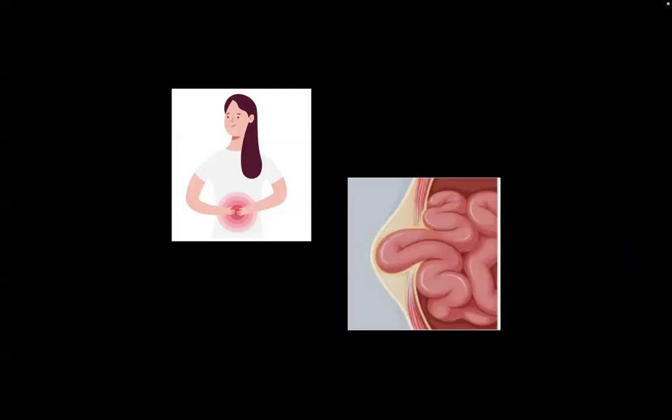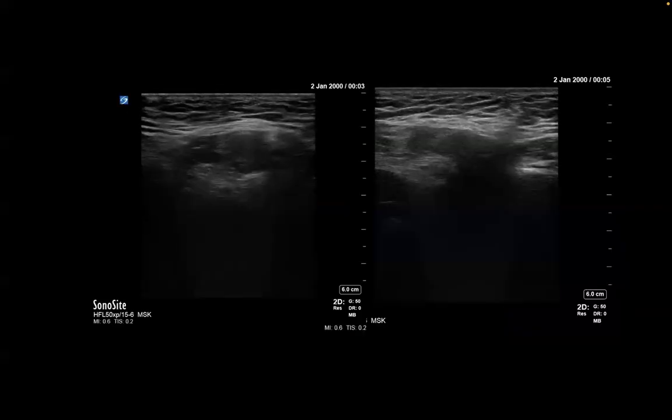Another common case in the primary care setting is a patient who comes in with an abdominal bulge and pain. And the question is, is this truly a hernia, or is there not a hernia? Again, in the very apparent cases, physical exam usually secures the diagnosis, but there are times when the bulge is so small that maybe you're not really able to tell on physical exam, or perhaps on the anatomy, it is a little bit tougher to be able to palpate this bulge.